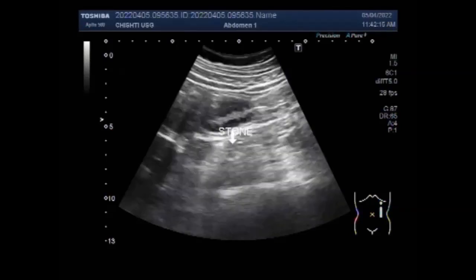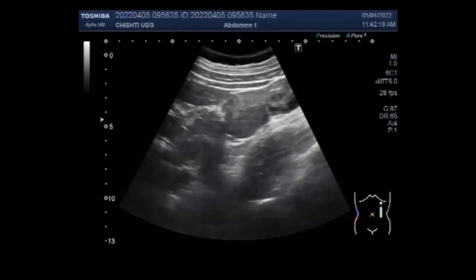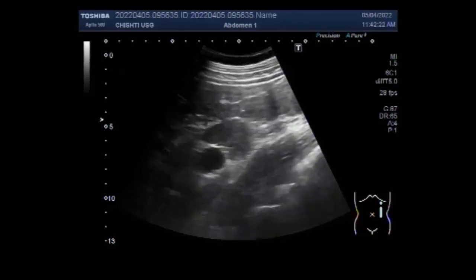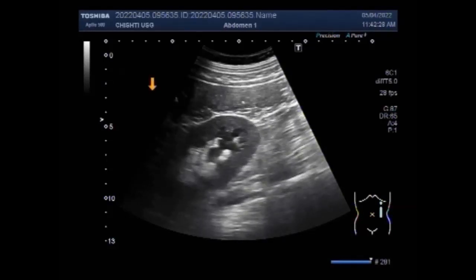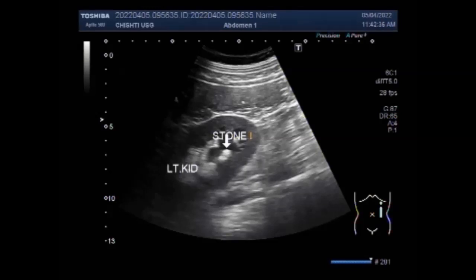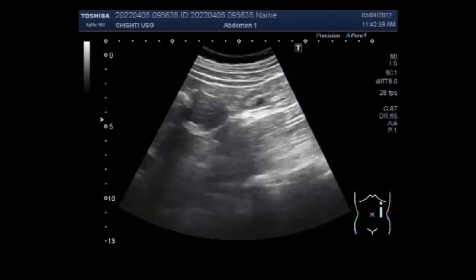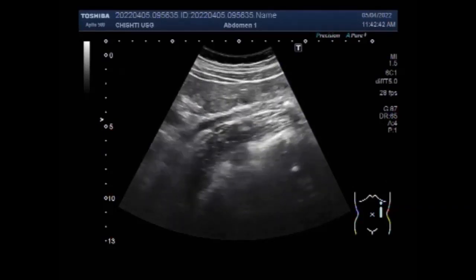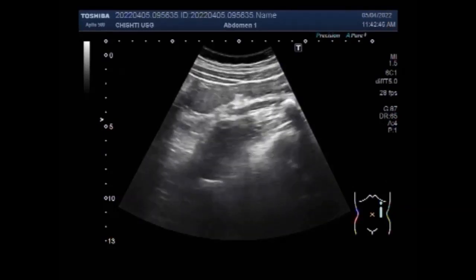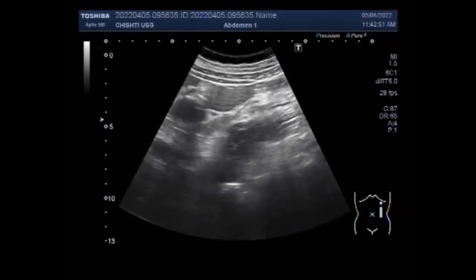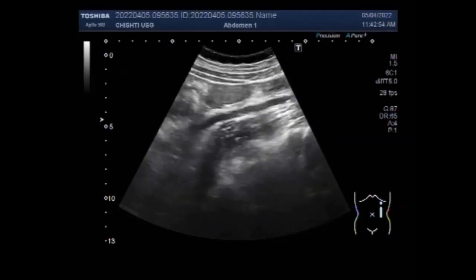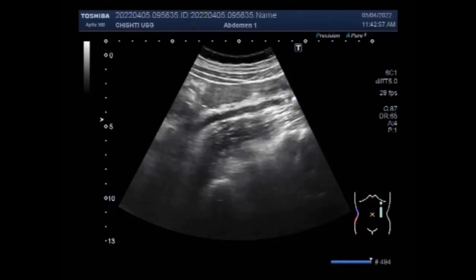Now you will see the focusing of the ureteric stone, and you can see the scanning of the ureter. This is the stone in the kidney. Now you will see the ureter being traced and the stone seen in the ureter; this stone measures around 10 millimeters, and small concretions are also seen along with this stone.